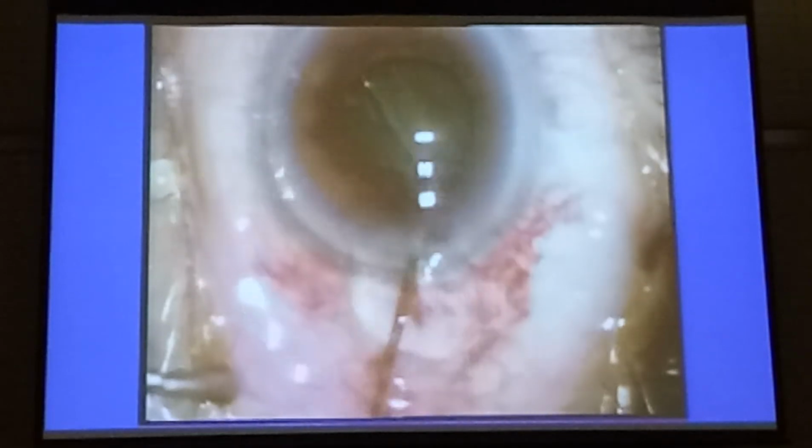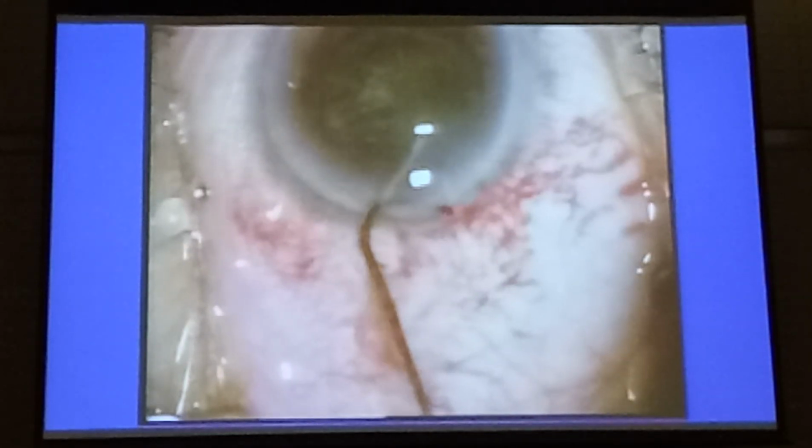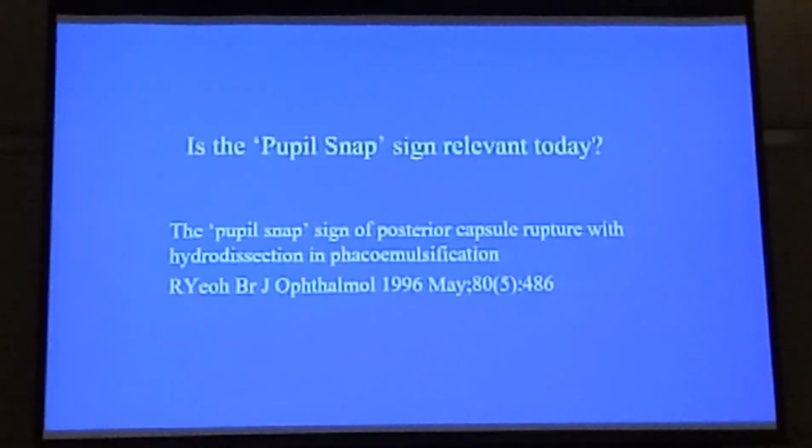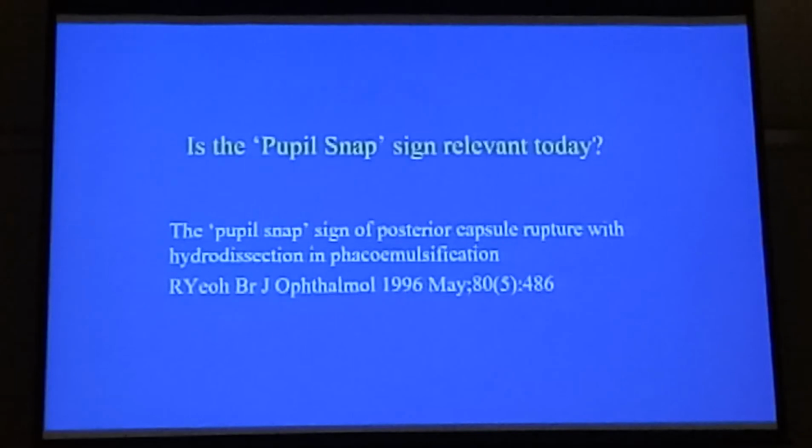So that nucleus is gone, okay? Once it's gone to the macula, of course, you've got to call your vitreoretinal colleague. So this is the hydrorupture of the posterior capsule. If you're too rough or too forceful, you will rupture the capsule, and when you pressurize the chamber with your Phacotip, you get the drop nucleus that you saw in the first clip. But this is uncommon. Most of you under-hydrodissect, but when you see this film, you will under-hydrodissect even more. But the secret is to get it just right.